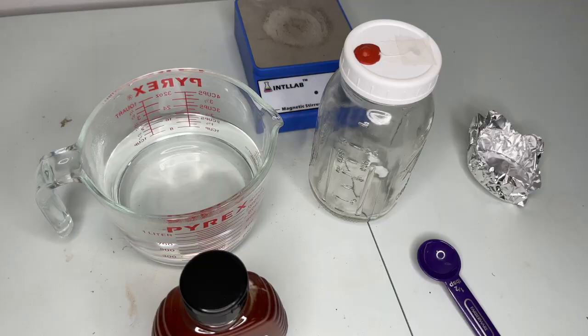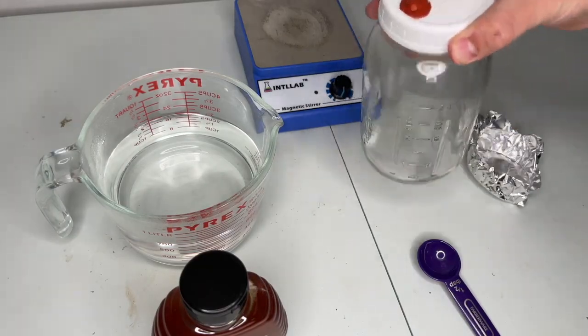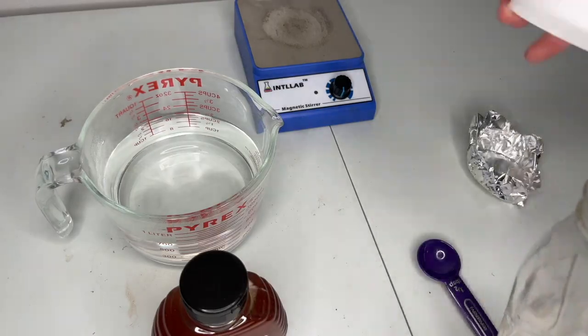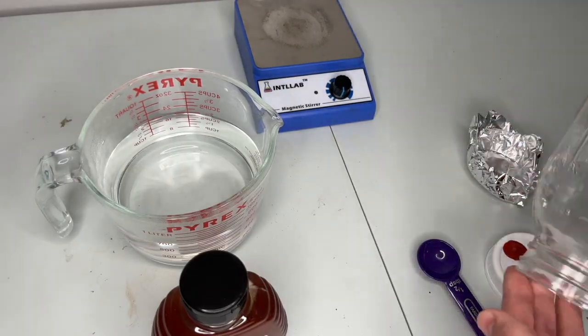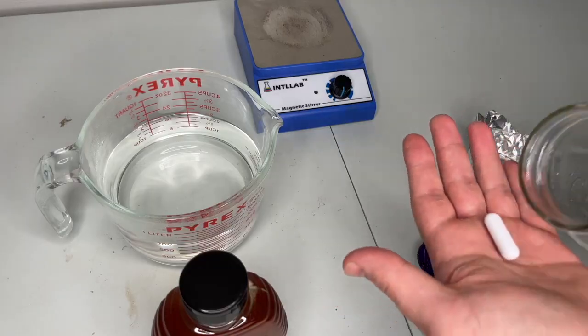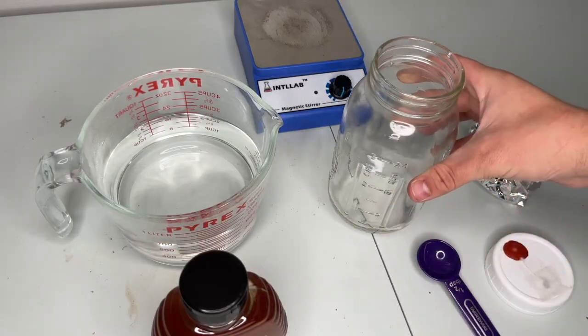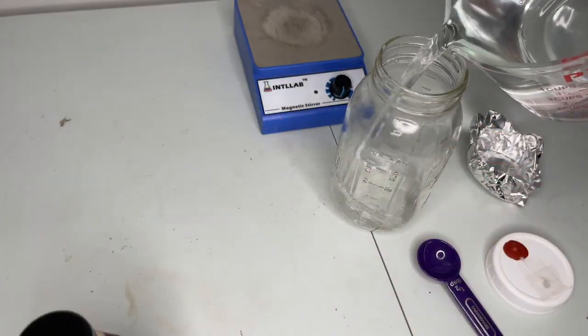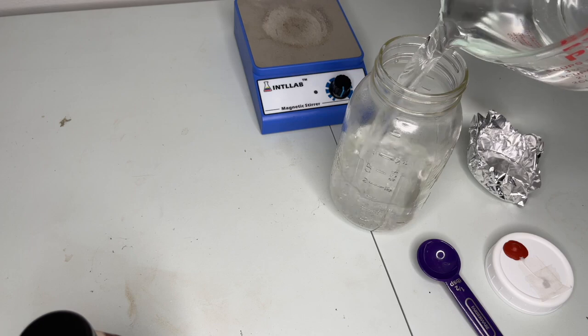The first step is to create a large amount of liquid culture. I like to use one tablespoon of honey dissolved into 600 milliliters of warm water. Using a magnetic stir bar is recommended to speed up the process.